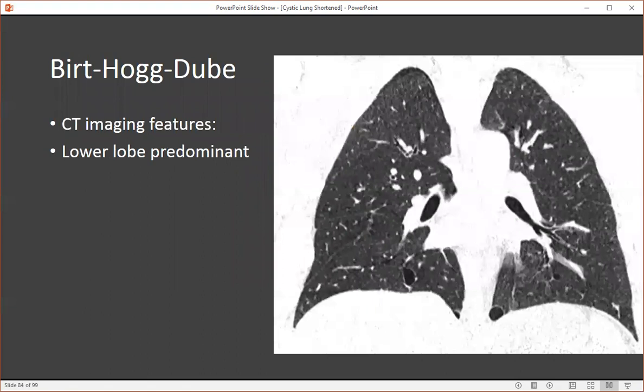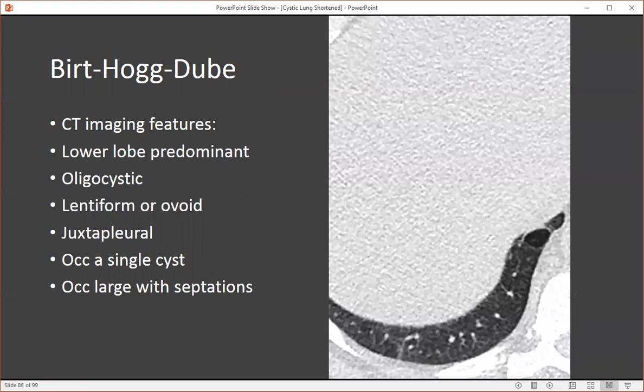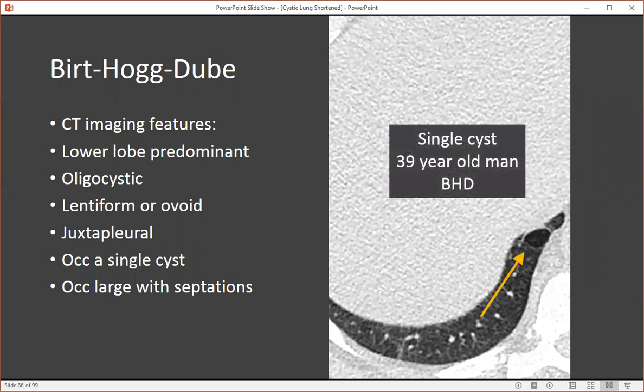Birt-Hogg-Dubé is characteristically associated with a triad of pulmonary cysts, skin lesions reflecting fibrofolliculomas — these white bumps on the neck — as well as multiple and bilateral renal tumors, which can be both benign and malignant, particularly chromophobic renal cell carcinoma. On CT, we see a lower lung zone predominant cystic lung disease like LIP, and like LIP this is often oligocystic. However, differentiating features include a lentiform or ovoid shape, often juxtapleural or perifissural. Occasionally you may see just a single cyst with a thin septation. This 39-year-old man had a single septated cyst in his lung that wasn't even reported in the impression of the radiology report. However, the pulmonologist noted this person had a family history of renal cell carcinomas, found the cyst in the radiology report, sent the patient for genetic testing, and he was subsequently diagnosed with Birt-Hogg-Dubé.